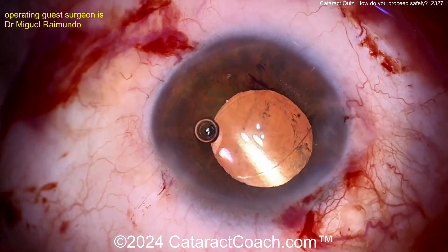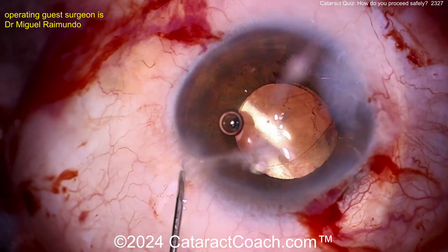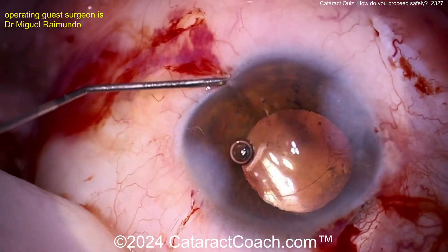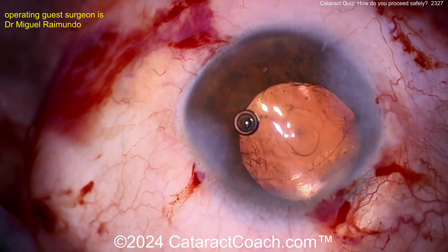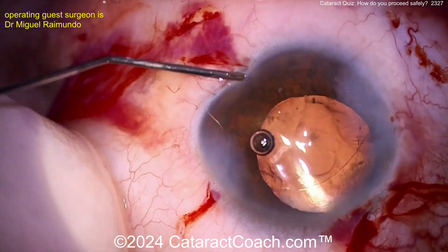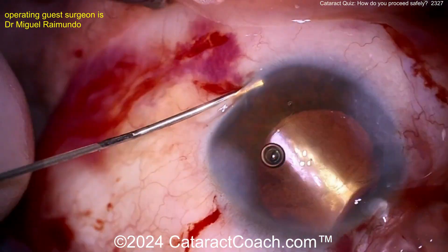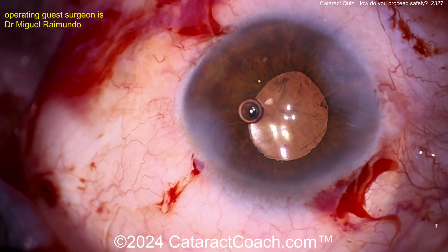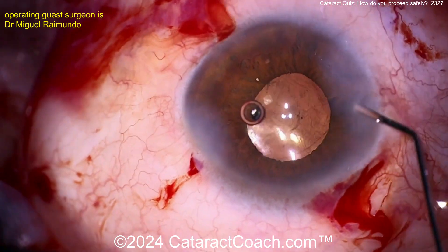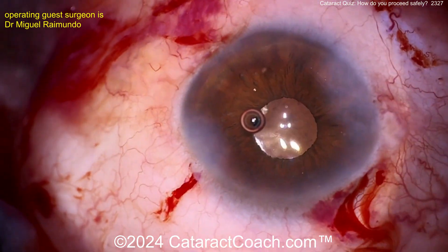At the end of the case, keep in mind: higher risk of macular edema, higher risk of retinal detachment, higher risk of endophthalmitis. This case definitely deserves intracameral antibiotics — preservative-free moxifloxacin or cefuroxime, whatever you prefer. Watch the patient closely in the post-op period. Seal up the incisions, hydrate them — if there's any leak, it's okay to put in a 10-0 nylon suture; that's no big deal.